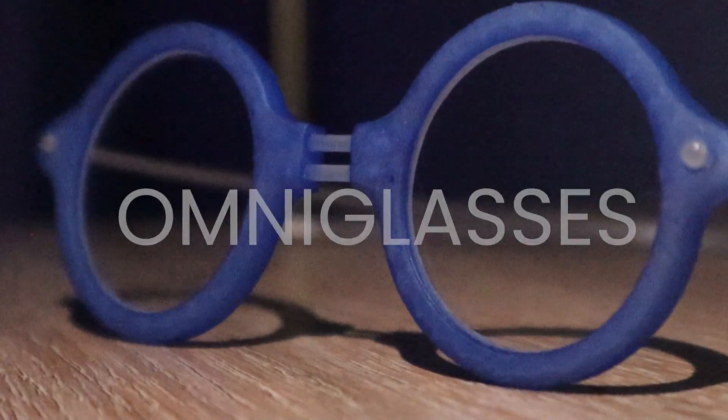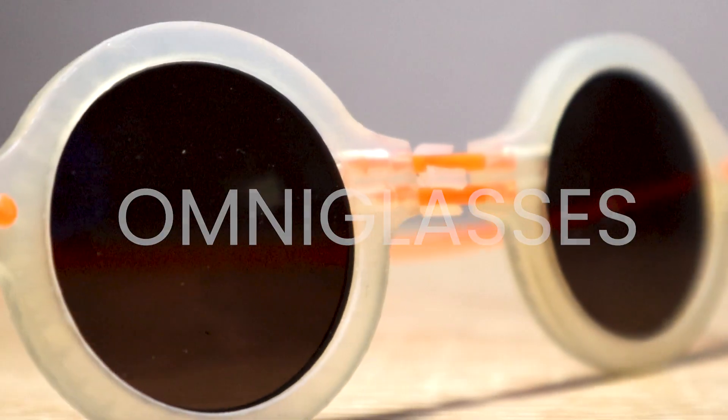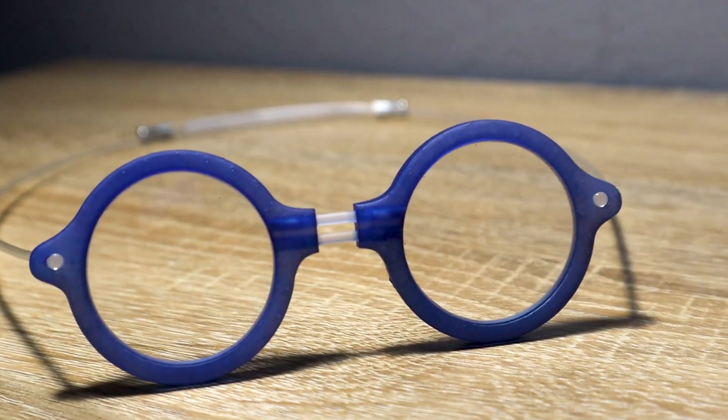Introducing the Omniglasses. These 3D printed Omniglasses make vision correction more economical, equitable, and adjustable.